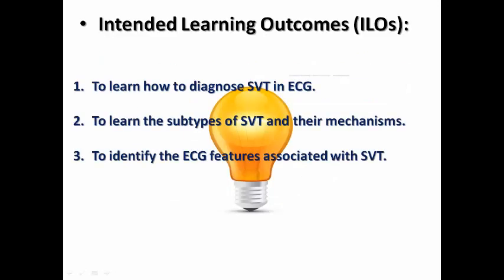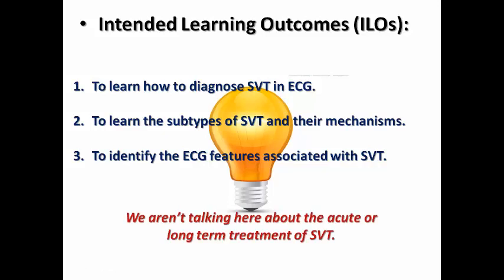Our ILO today is to learn how to diagnose SVT on ECG, to learn its subtypes and their mechanisms, and to identify the ECG features associated with SVT. And again, we are not talking here about acute or long-term treatment of SVT. We are just concerned with the ECG diagnosis.